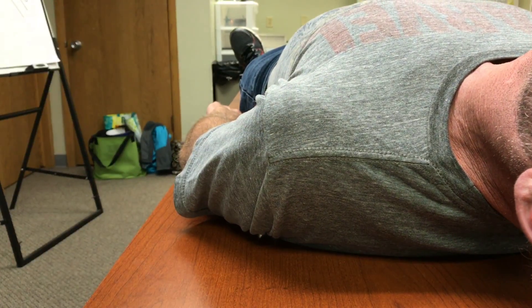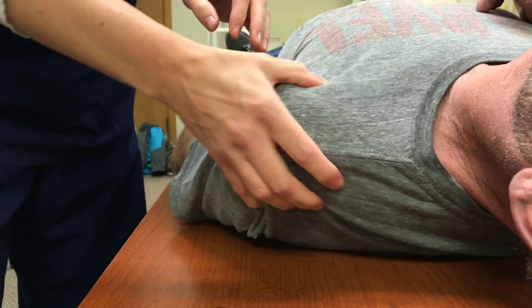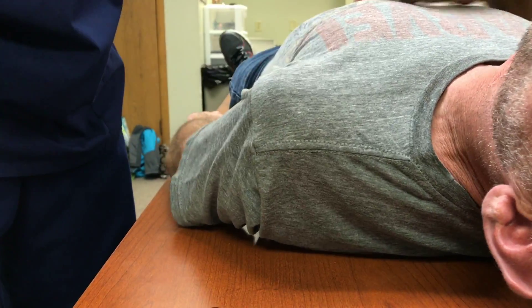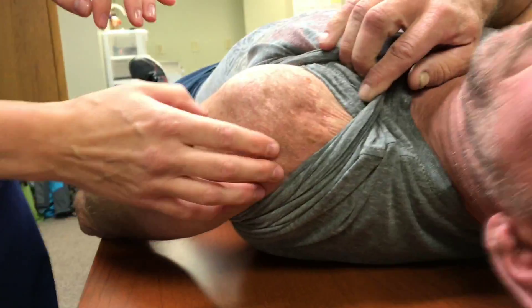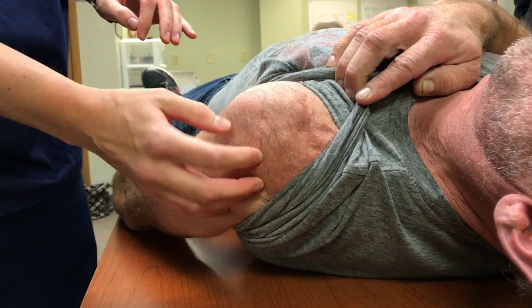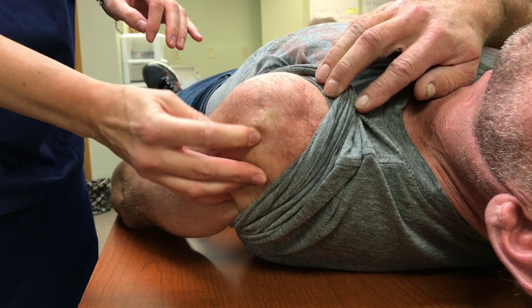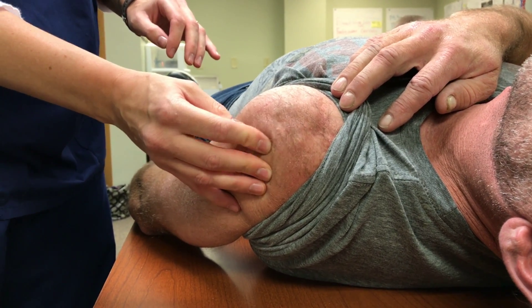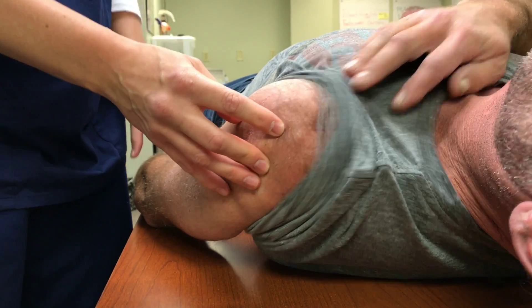Check for the acromion process as a landmark concern. Also check for any scars or hardware — on this patient there's no hardware palpable, but some patients you may not be able to feel the anatomy as clearly.